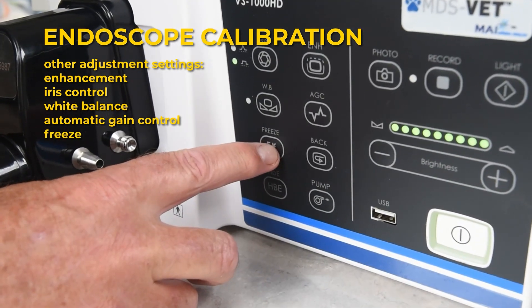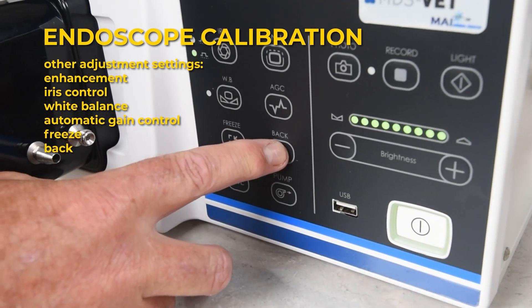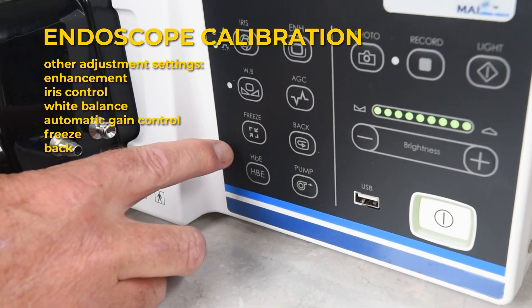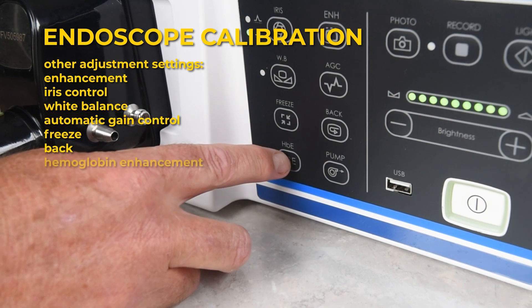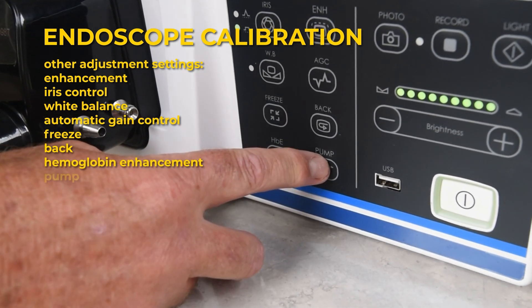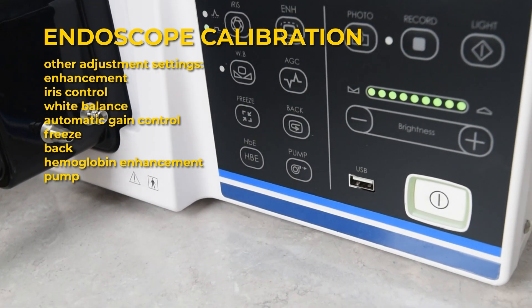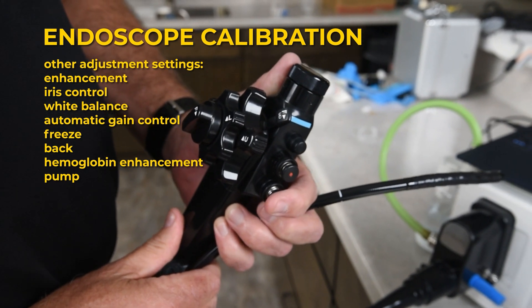The freeze button freezes the image on the screen. The back button will scroll through the last four images. Push freeze again to go back. HbE stands for Hemoglobin Enhancement — this button enhances and defines vascular tissue. The pump button pressurizes the system so that the endoscope has automatic air-water delivery through the blue and red buttons.